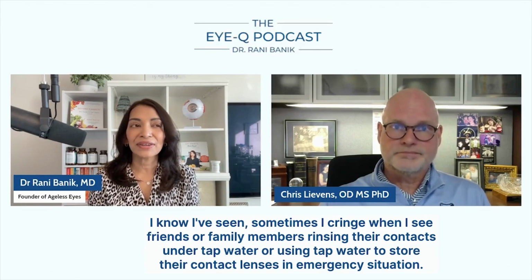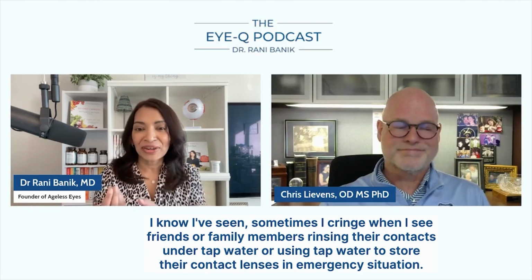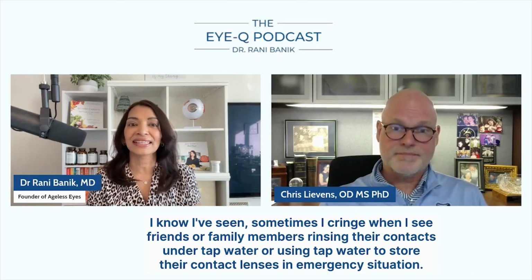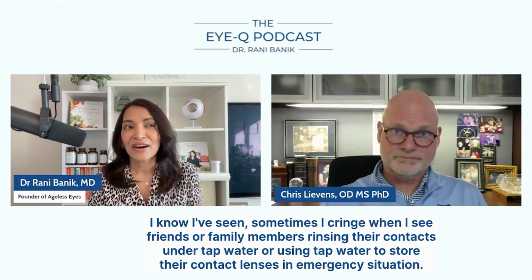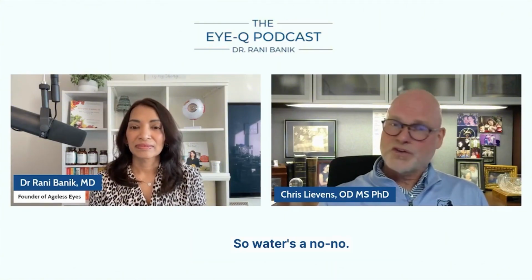I know I've seen, sometimes I cringe when I see friends or family members rinsing their contacts under tap water or using tap water to store their contact lenses in an emergency situation. What are your recommendations for cleaning solutions? Yeah, so water's a no-no.